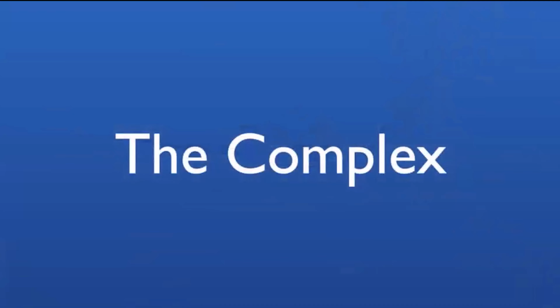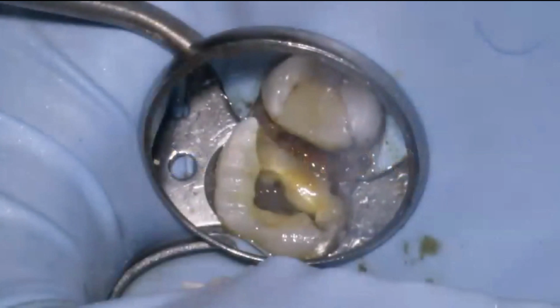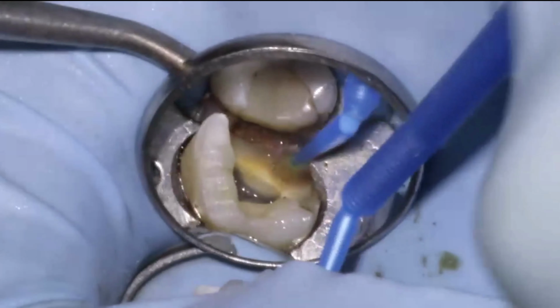And then finally, the complex buildup. This is the one that deters people from using GentleWave. With proper planning, you can get away with it. It's not so difficult. So I'll show you a case where it's really broken down. This is after, obviously, caries removal, shaping. We're ready to run GentleWave. So you can see how beat up this tooth is.